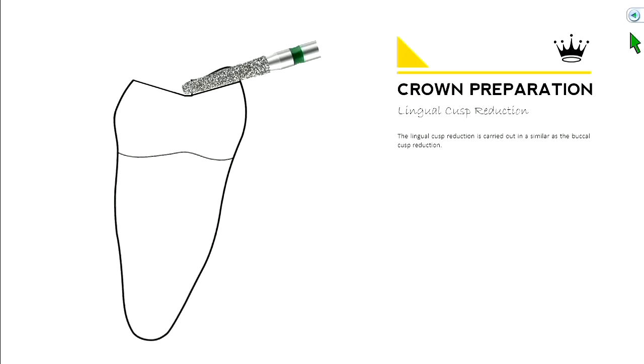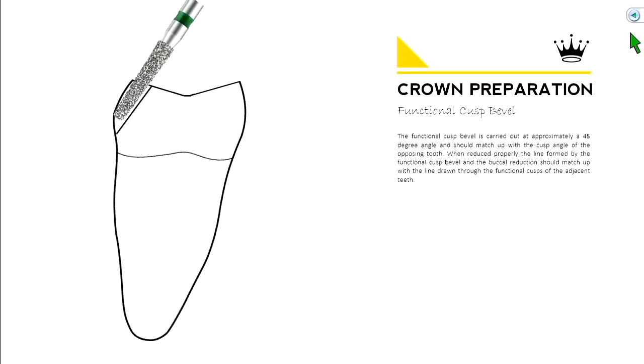Then you want to uniformly take down your buccal cusp. Take a burr, orient it sideways, and drop it — notice how it follows the angle of the cusp. Then do the same thing on the lingual, drop that down. On the occlusal surface, you've now reduced your buccal and lingual cusps evenly.